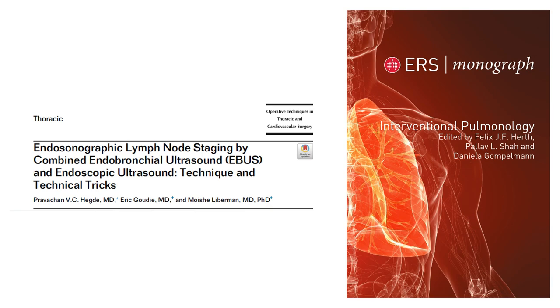So, oppose the scope well to the mucosa, continuous suction. As we know, air is an enemy of ultrasound. You don't want any air in between. And also, opposition is important for you not to throw the needle in the intramural area, and then go transmural into the target.